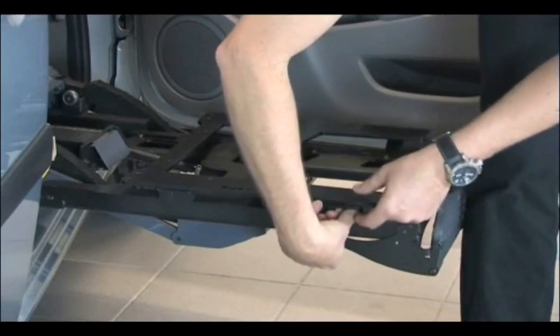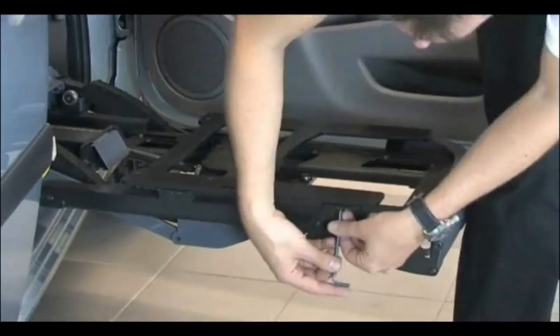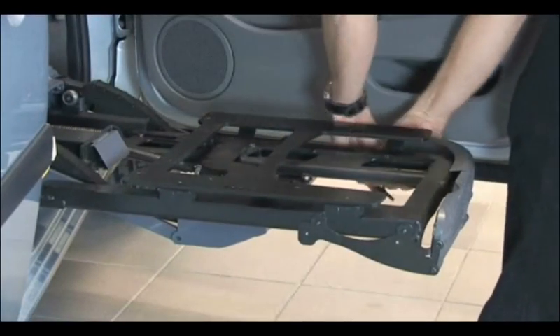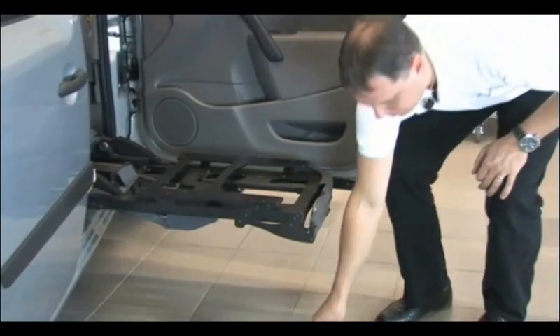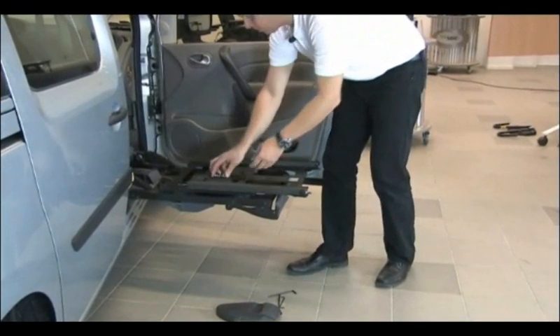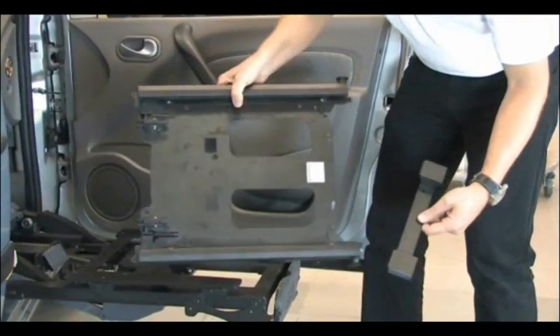And as you can see, I've already taken away the shrouding that sits normally around the corner here, so I get access to the screw. So when it's tightened, we now have prepared the surface for the docking plate. The docking plate itself comes in two pieces. One is a small cover and the other piece is a large bracket that is pre-assembled and ready to install.